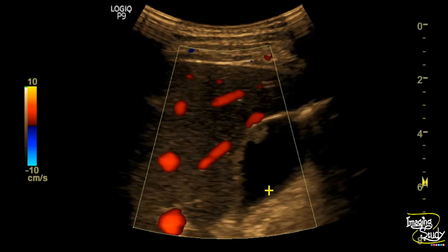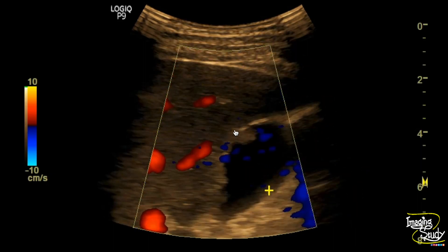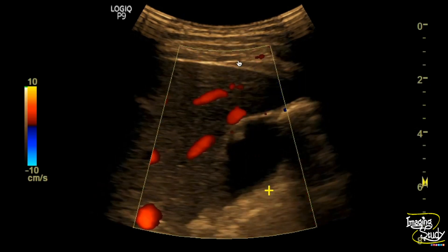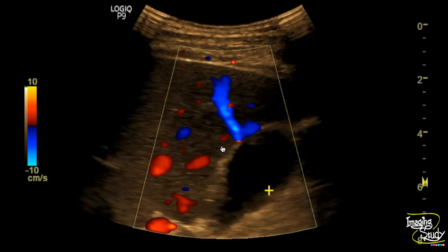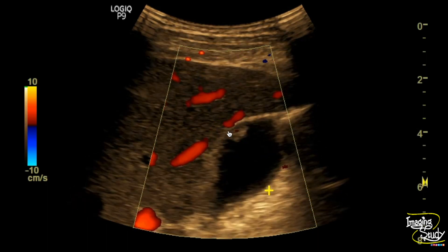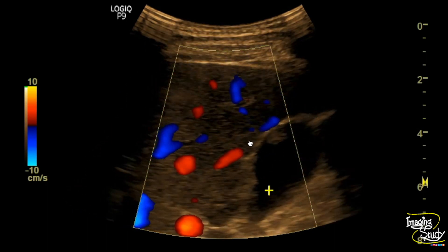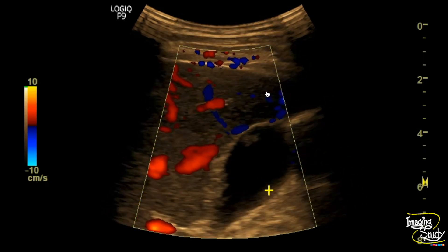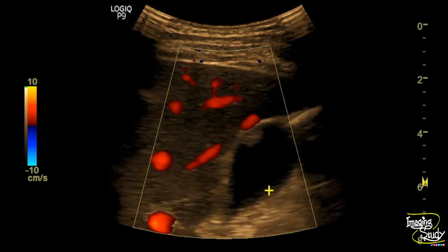Here you can see the magnified view of the gallbladder with color Doppler. You can see a small polypoid lesion at the anterior gallbladder wall with intact overlying hyperechoic serosal layer. If you check carefully, you can see a prominent vessel supplying this polypoid lesion, indicating the possibility of a mass with good blood flow.